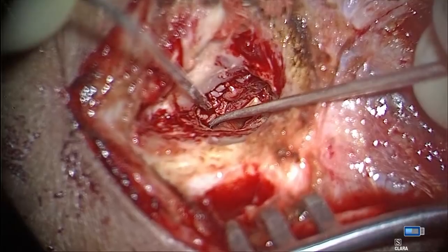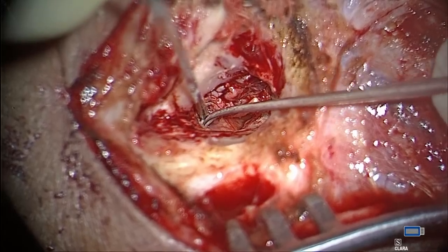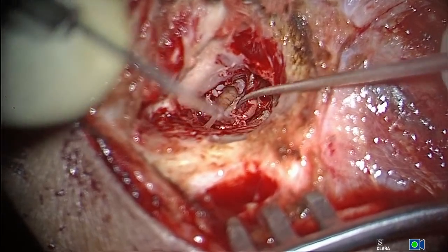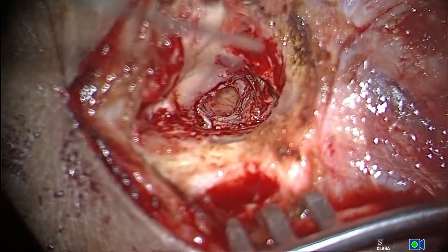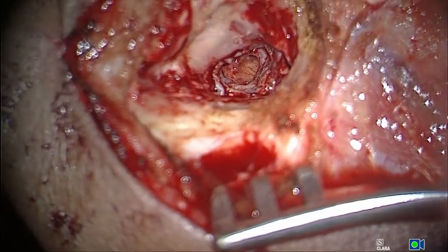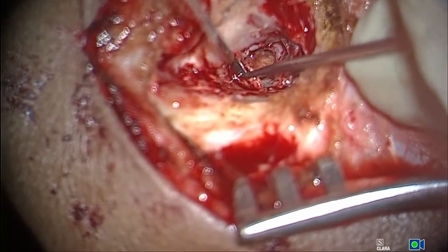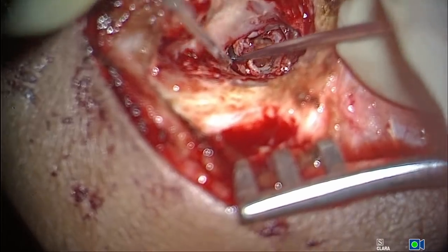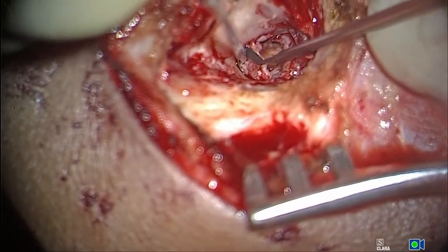Elevator. Plaster, please. So you can see that that's the flap here. See how nicely the flap has been elevated. Very beautiful. Can you all appreciate it, please? The size of the perforation also almost remains the same, a little bit more, but not a subtotal perforation for sure, which many people have seen. Actually, I saw a video very recently of endoscopic ear surgery, and they were actually tearing the whole flap. I felt miserable when I saw that video.